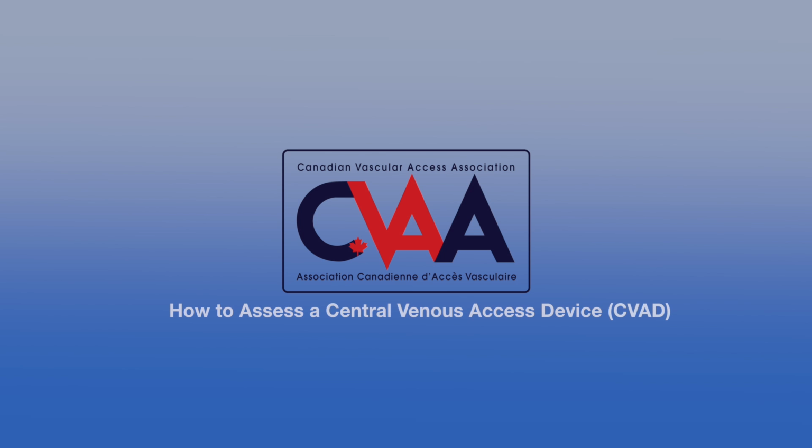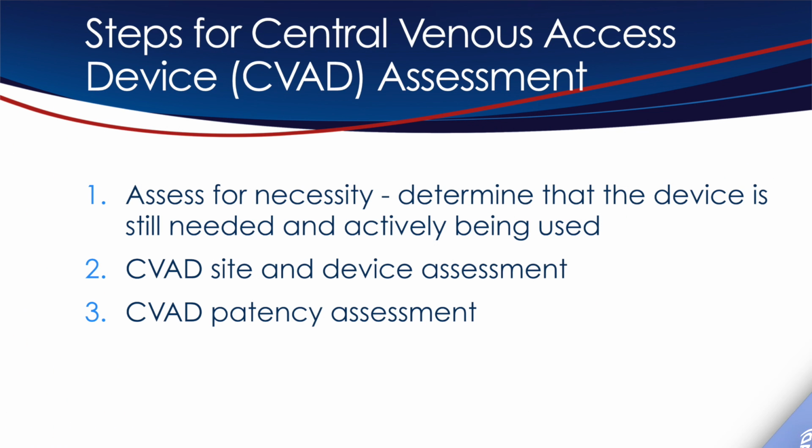Welcome to the instructional video on how to assess a central venous access device by the Canadian Vascular Access Association. There are 3 steps involved in the assessment of a central venous access device, or CVAD.